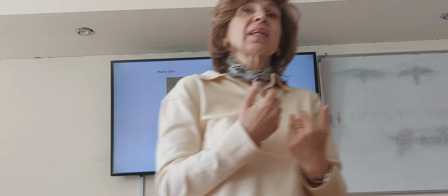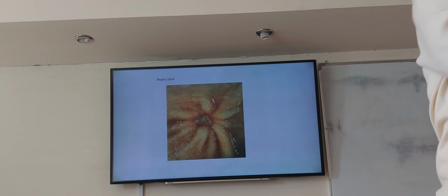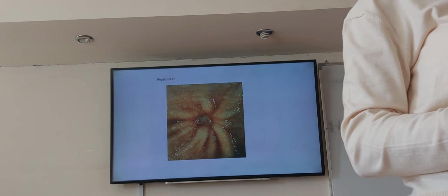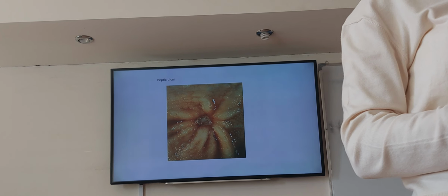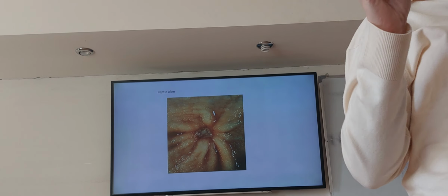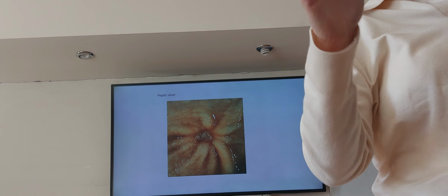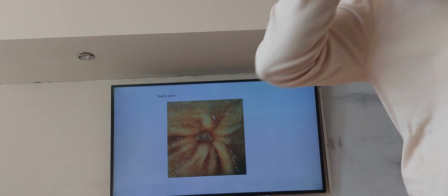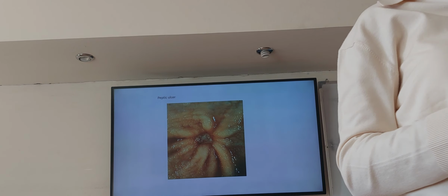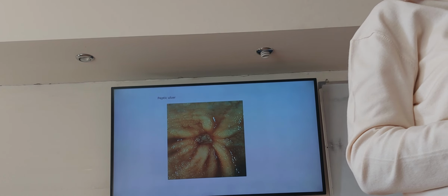Okay? Now, if the problem is chronic, what does it mean? It means that it started as acute ulcer, but it didn't resolve, so I am walking where? Toward chronic ulcer. Yes? Now, my question, I have said several times, and I want you to remember now: if I have acute ulcer that is transformed to chronic ulcer, and the body will try to close this ulcer, what I will see? Which tissue? Granulation tissue. Okay?